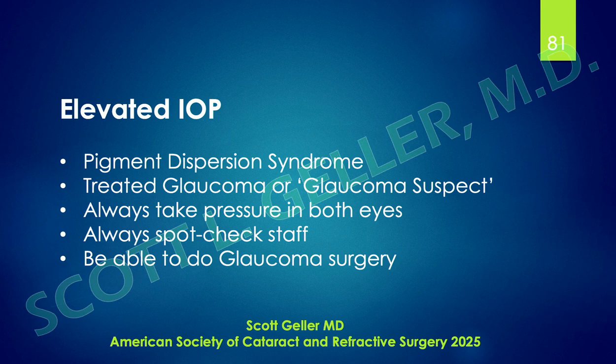So how do you have to be careful? Well, it's very simple. First of all, always take the pressure in both eyes. Always spot check your staff. And certainly be able to do glaucoma surgery. Not necessarily, but you want to be able to take care of your own problems, and you don't want patients running around town bad-mouthing you because you caused bad glaucoma.